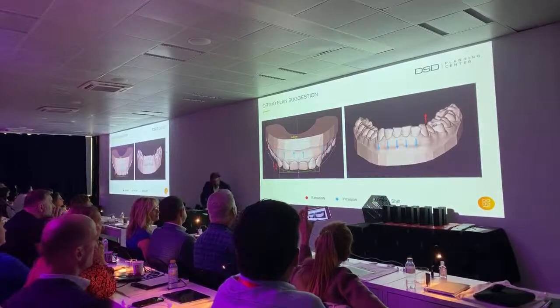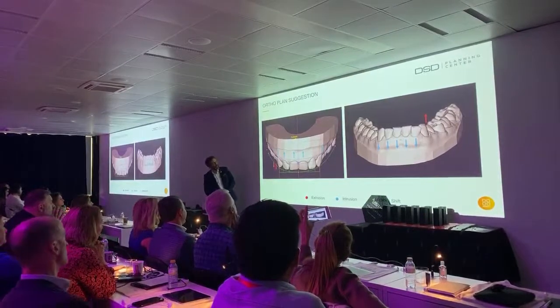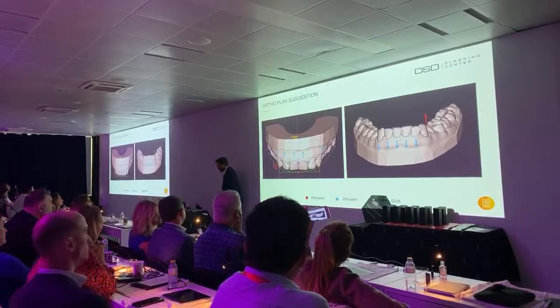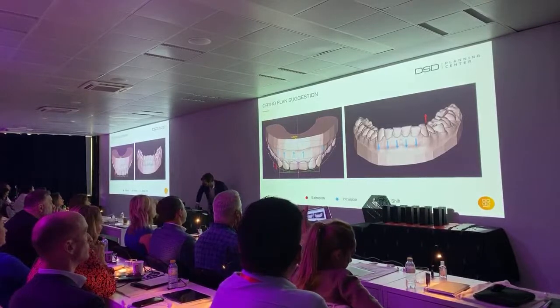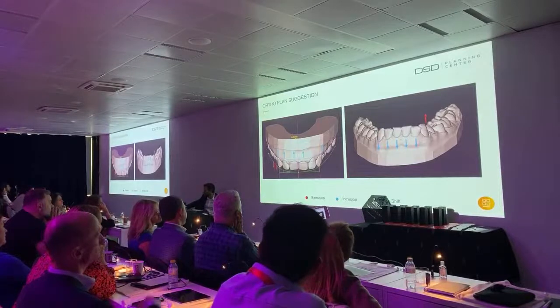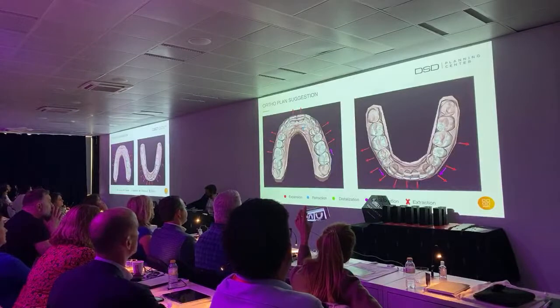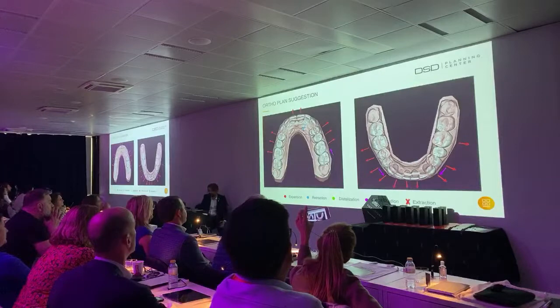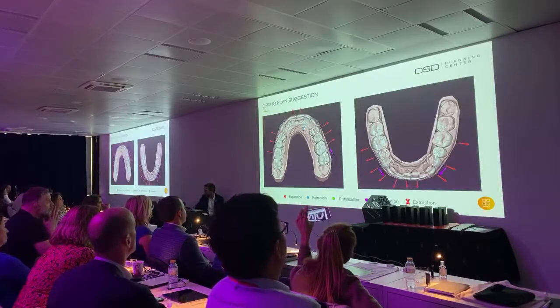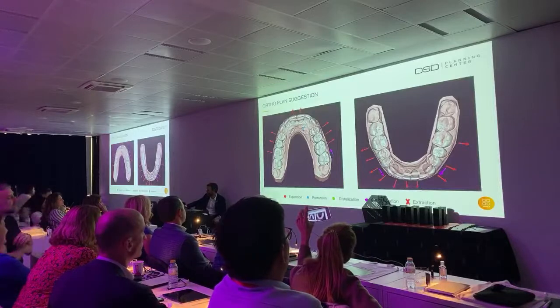I know it's very simple, very basic, but I think it helps somehow to explain to the patient some of the movements that will need to be done on different views. So that's not an ortho simulation. It's the ideal design over the actual situation of the patient, but it's to help communicate more than anything else.